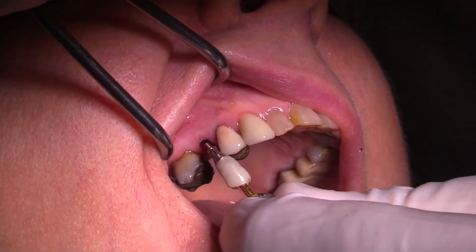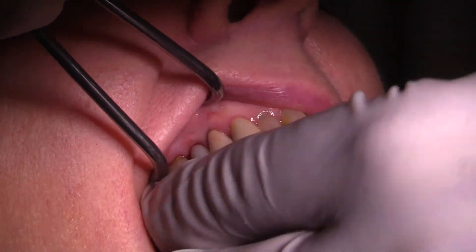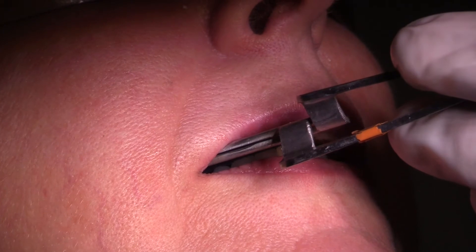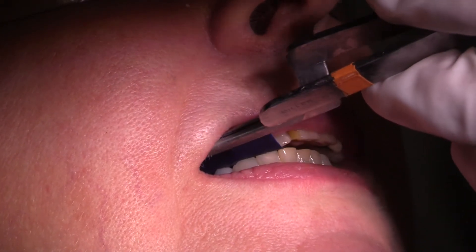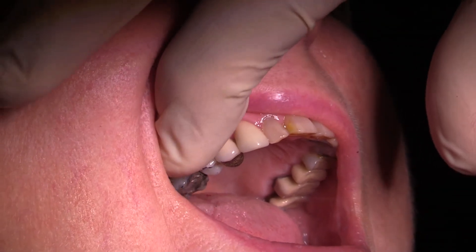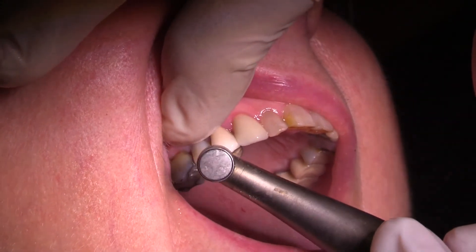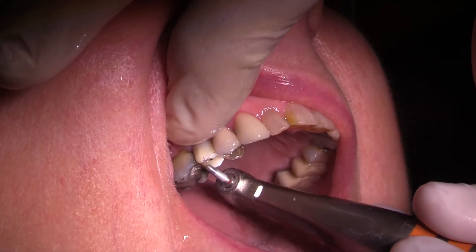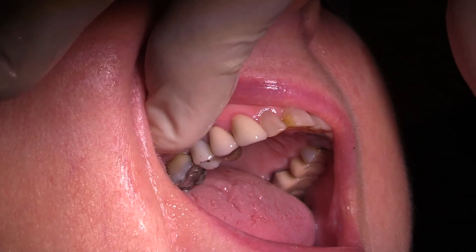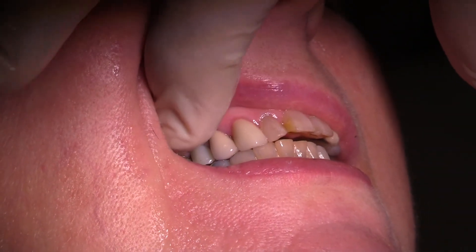We'll disinfect the temporary with chlorhexidine and come back to the mouth. I'm working on the other side looking at a TV as we put this in place and tighten it down. Since the implant is at 70 newtons, I can tighten with my hands to about 10 to 15 newton-centimeters. We can then check the occlusion — these were some of the first ones I've made and the occlusion was very close. Patients come back saying they really didn't feel much at all, with the implant and temporary all placed the same day in a digital workflow.